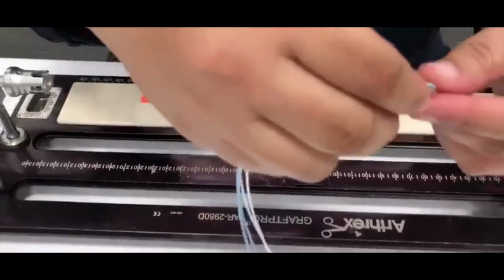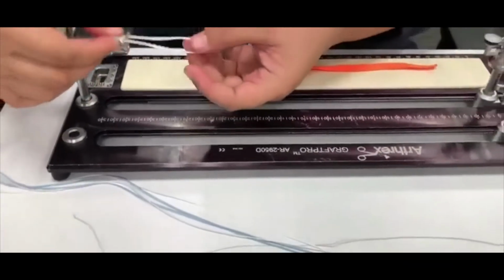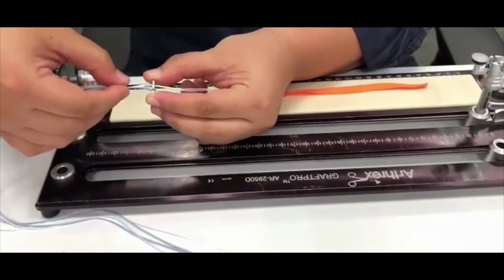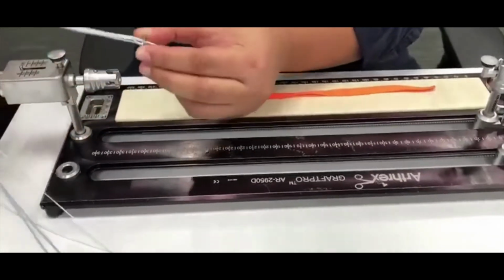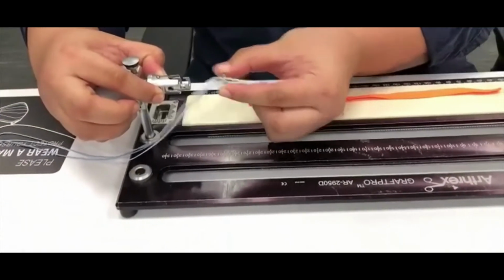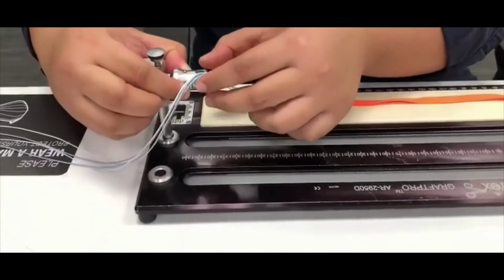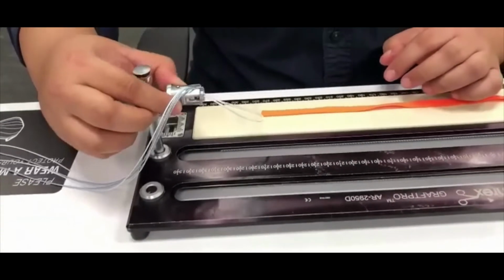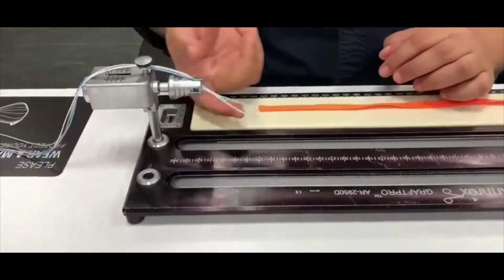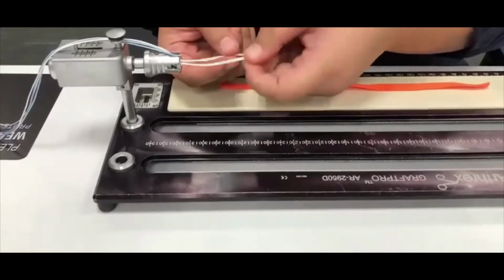So we will put the TightRopes first. This TightRope will go here, femur. How you hold it is you hold by the sides of the button, making sure all the sutures are on top of the button, this blue one especially. And then make sure it is away from the board. Pull the head back and slot it in. It might be a little bit tough when you are wearing gloves, but don't worry about it. This is how it's attached, close all the way down. Sutures away. The loop is as such. It did not go the other way, so we just follow through.